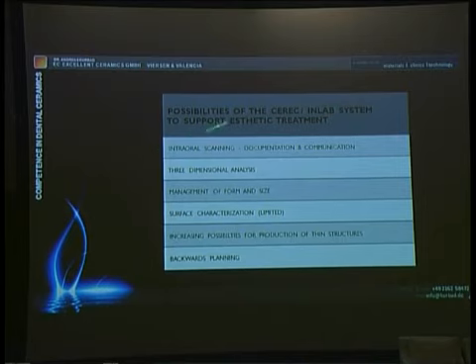At first, and this is a very interesting thing, it started maybe 1 year ago with the last IDS, we have this possibility for intraoral scanning. We scan, we don't work with the classical impression, we scan. And we can do this for documentation and communication. Every case we start not only with an X-ray and the clinical examination, we make an intraoral scanning. And if I want to communicate with the lab in this problem, I don't need a model. I can send him a file and he can have a look.